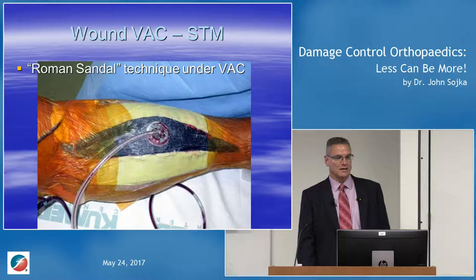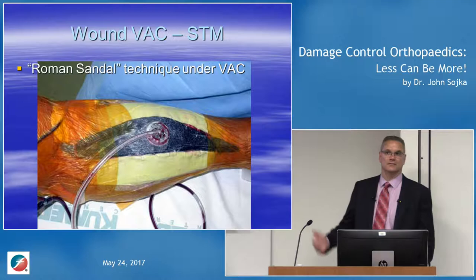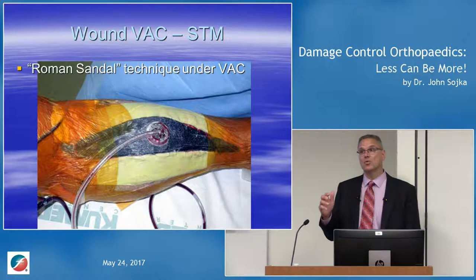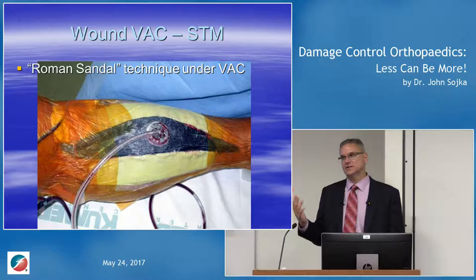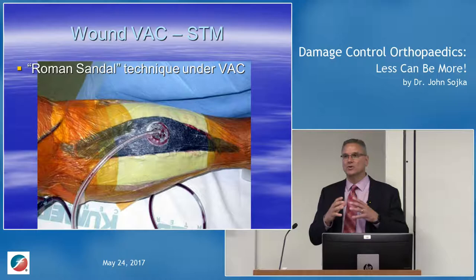I like using wound vac systems, and I'm not going to tout any particular company's wound vac over another, but they all work very well. We did not necessarily have these when I first started my training in the late 90s. And a lot of these soft tissues got covered with just saline-soaked gauze. What happens is you get the skin edges retracting, and the wound is actually bigger by the time you get done with it, because we've all seen that woody appearance to the wounds as they've been multiply debrided. And it becomes a real problem for coverage.